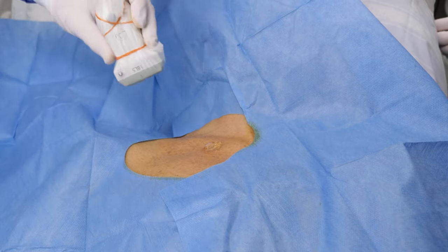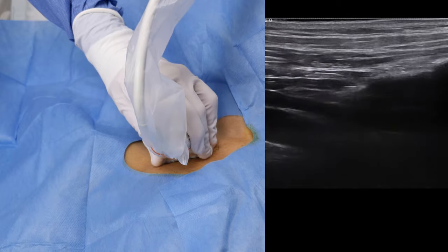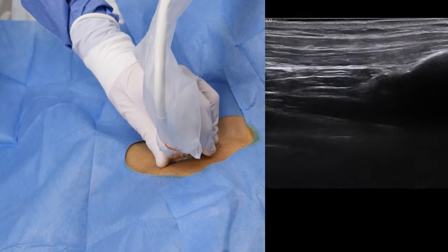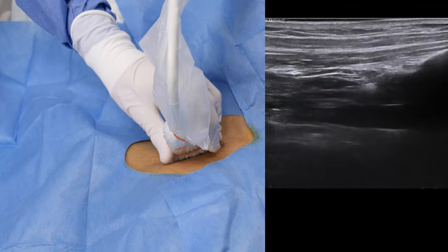Place the drapes and make sure to leave some space on the neck above the clavicle. Position the probe as far medially as possible, where the vessel is less prone to collapse and the diameter is larger. This is especially important in the hypovolemic patient.